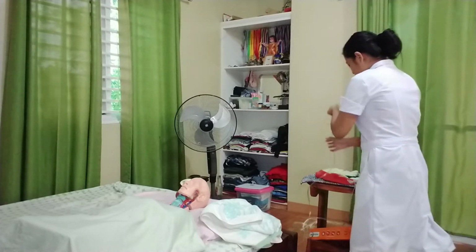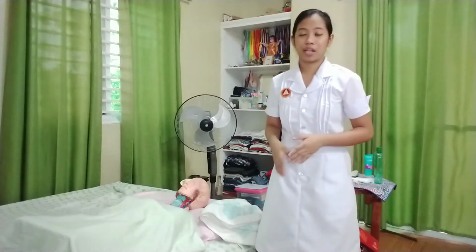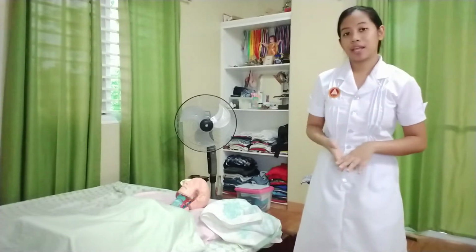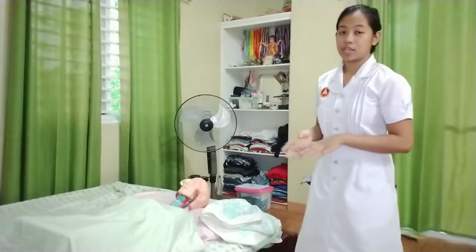And then after that, I will now be introducing myself to the patient and verifying my client's identity, explaining the procedure, why it is necessary, and how the client can cooperate. Also, I will be instructing my client that there might be a feeling of fullness once I administer the enema solution.